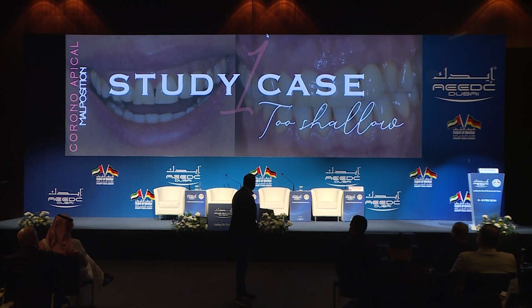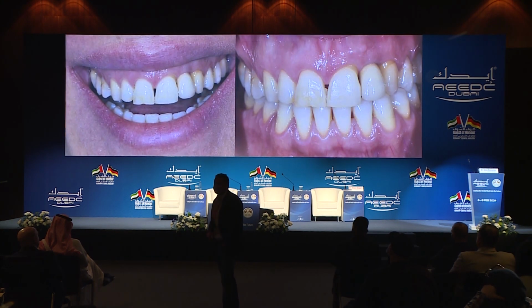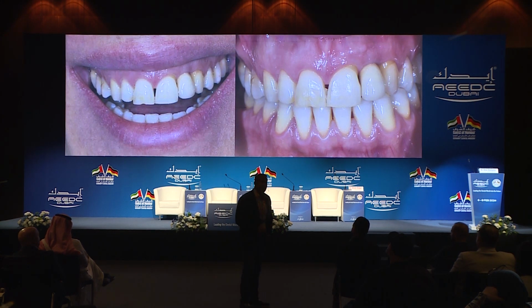So another one, what if you place your implant too shallow? Placing the implant too shallow, in today's implant dentistry, is really malpractice. This is a patient who came back in 2012. She had this implant placed, a shallow implant placement. And this lady has a social media company. She has 3 million followers, okay? So imagine the stress, worse than a lawyer, right? Because if you do something wrong here, your name is gonna be on all the social media platforms.